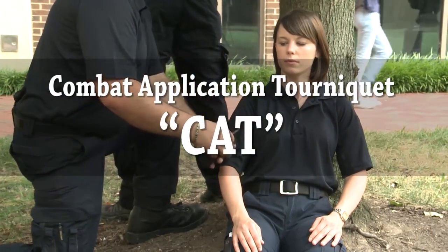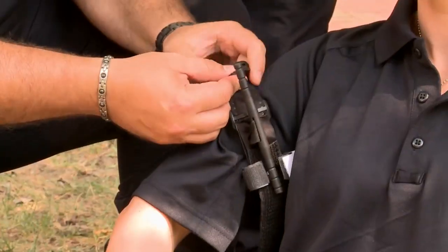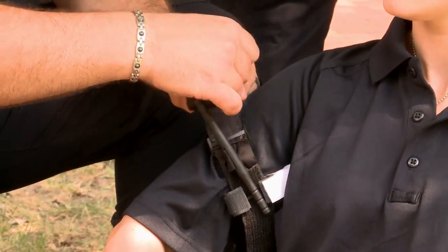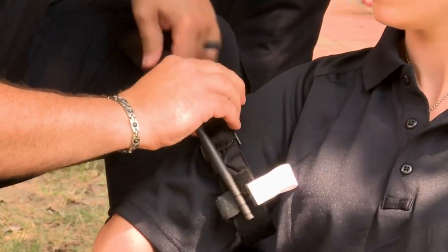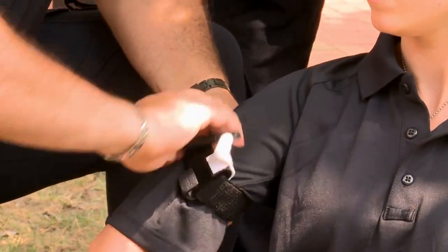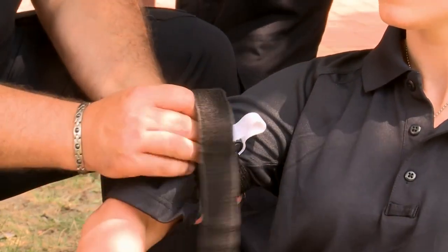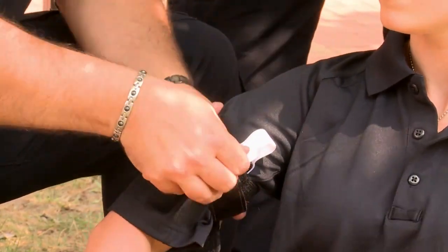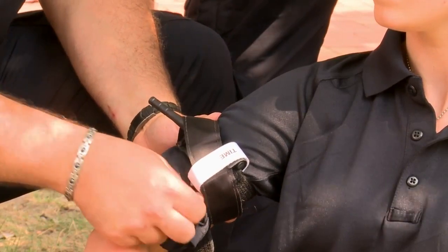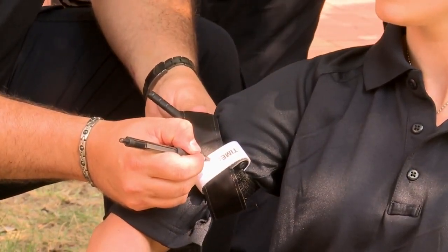The Combat Application Tourniquet, or CAT. Open the Velcro on the band. Place the tourniquet around the extremity and secure the band back onto itself. Do not adhere the band past the rod clip. Twist the rod until all blood stops flowing from the wound. Place the tourniquet handle inside the rod clip. Adhere the band over the rod, inside the clip, and fully around the limb. Secure the rod with the band strap and document the date and time the tourniquet was applied.